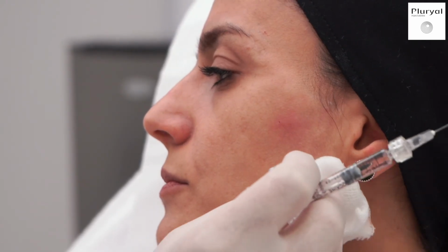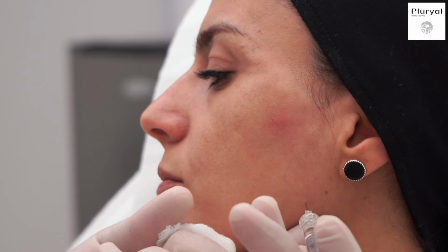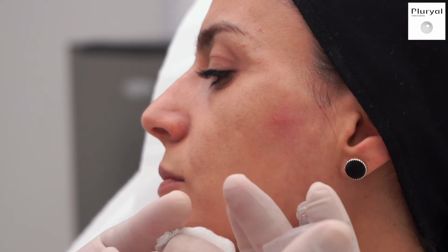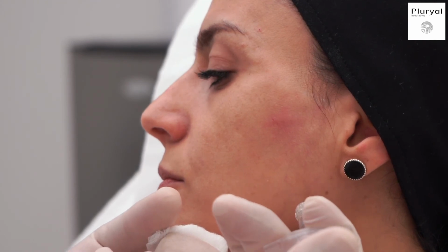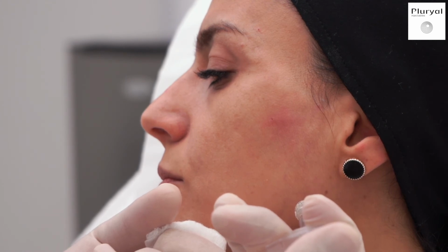So now I will be using Pluryal contour lidocaine for the mandibular angle. I go deep to the bone, give a bolus of 0.25.